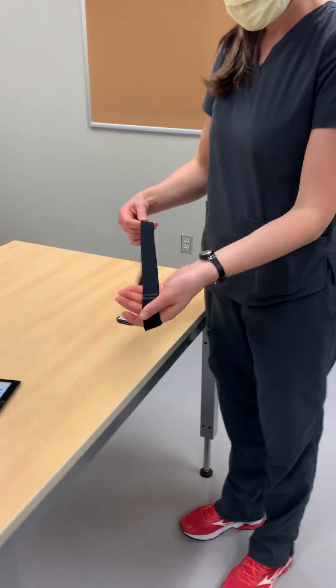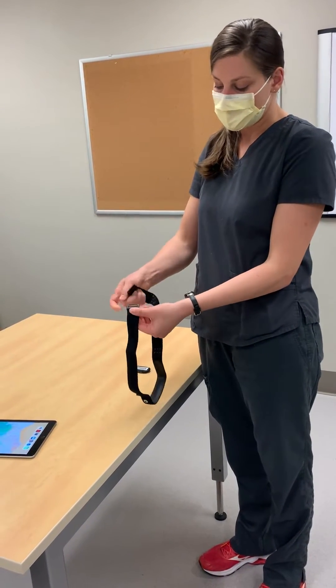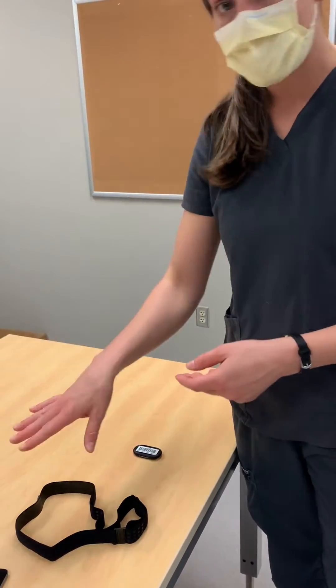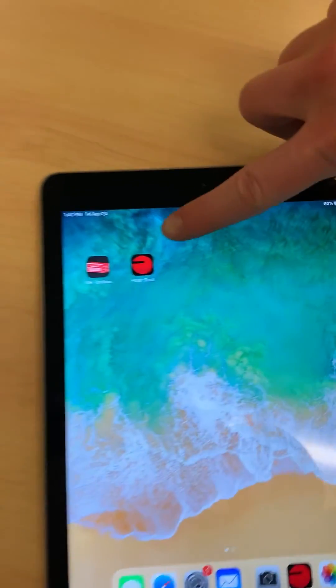Next we have a strap. It's adjustable so you can tighten and loosen as appropriate for whoever you're working with, and it opens and closes just right here. And then we have a tablet. On that tablet you'll need to make sure that you've downloaded the Polar Beat app.